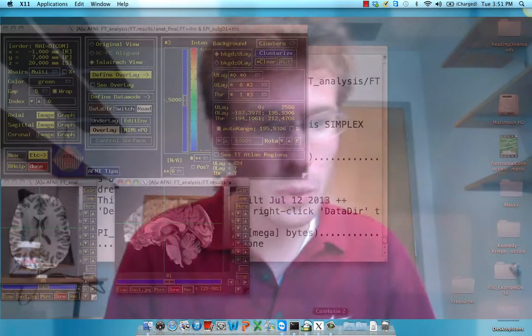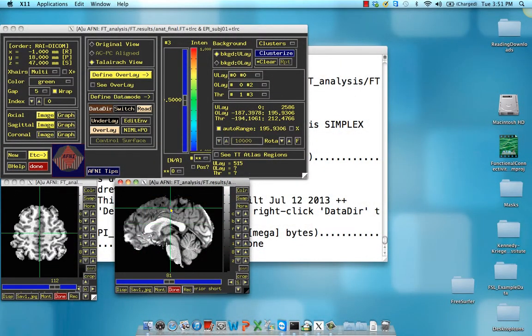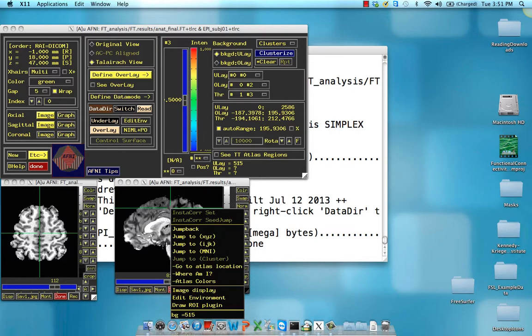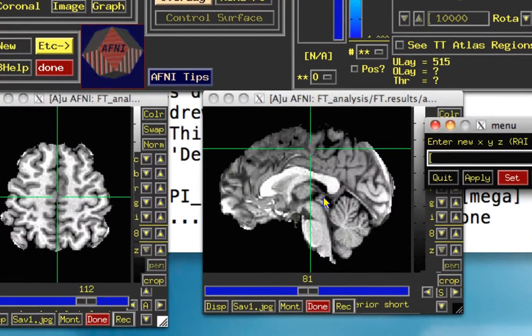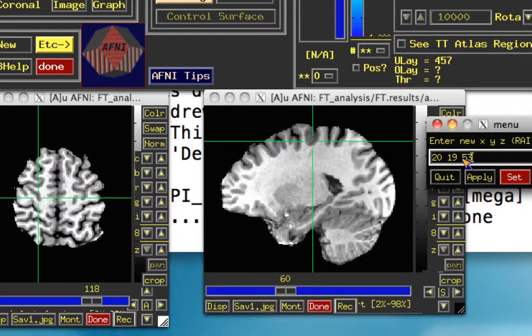So right now, what we're going to do is we are going to select one of those voxels. And here, I already have one picked out. I'm going to jump to XYZ, and I'm going to select X20, Y19, and Z of 53.